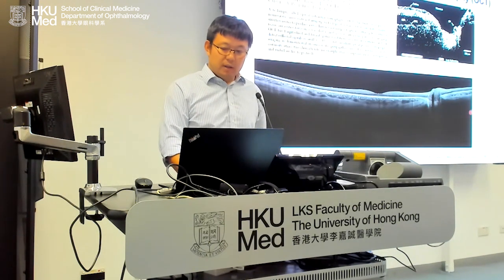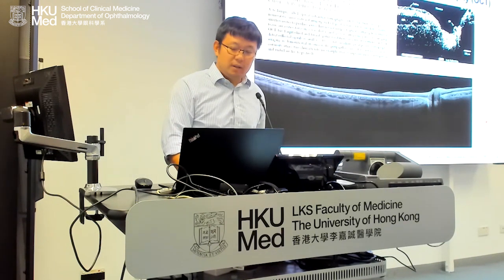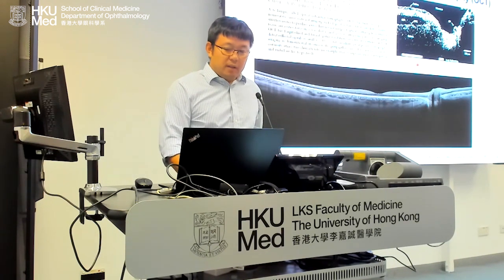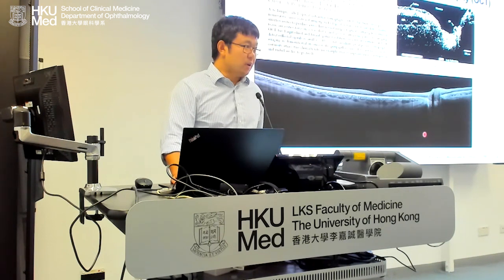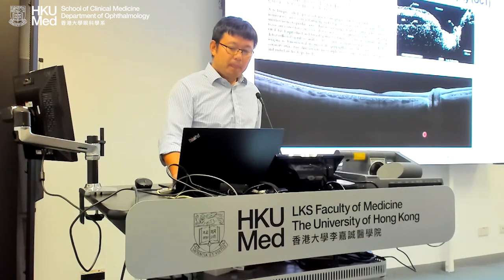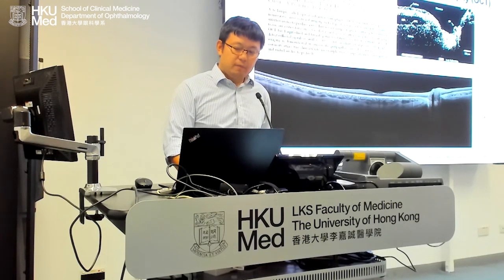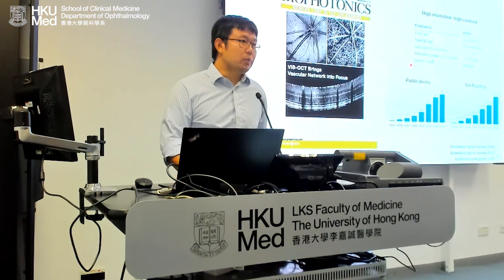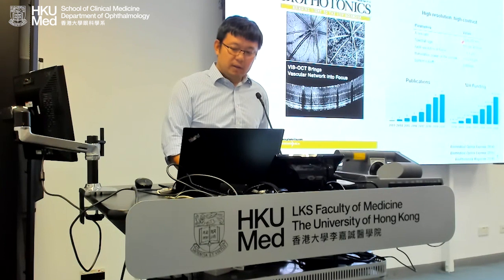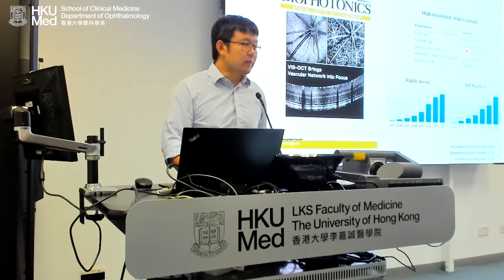This is the latest one, center wavelengths around 1040 to 1330, swept source OCT. Over the years, that's been a technology migration, and it greatly improved the quality of the imaging. But I'll focus on the two wavelengths, right? 830, 840, and 1040 to 1330. Now, we move to shorter wavelengths. If you focus on here, we're talking about 510 to 610. So this is almost half of the wavelength compared to the longer wavelengths.